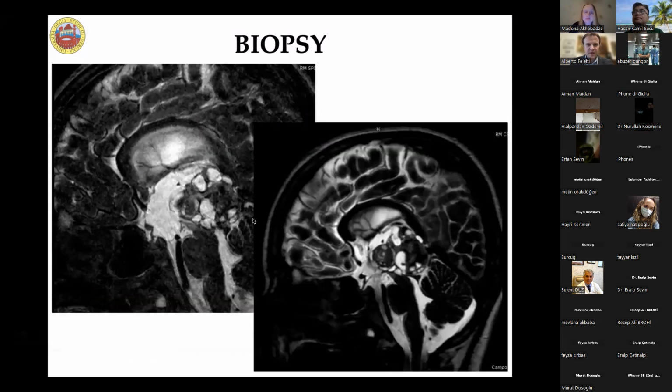see. This is the result, preoperative MRI, and this is the postoperative MRI. Of course, the tumor is there, but it was a radiosensitive tumor, so the patient went for radiotherapy. But please notice the shape of the anterior third ventricle, which recovered its normal anatomy.